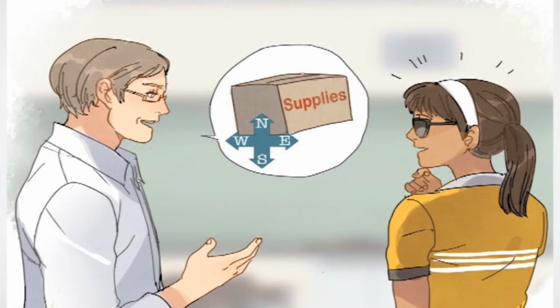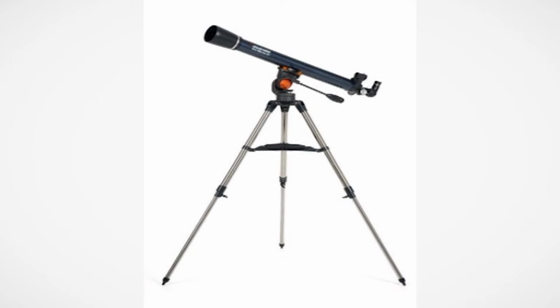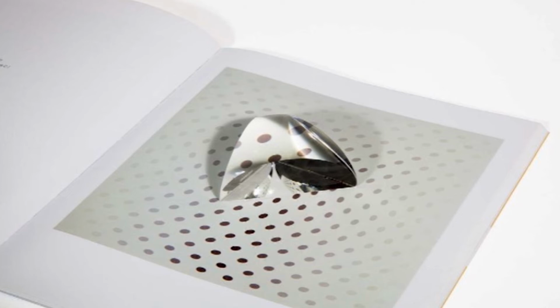These devices are used by blind and visually impaired persons who have severe low vision conditions. Optical devices such as the magnifying glass involve the use of lenses to improve vision. Categories of low vision devices. The two most common low vision devices are magnifiers for seeing objects close at hand, known as near viewing, and telescopes for seeing objects far away, known as distance viewing. Optical devices or aids use lenses or prisms to magnify, reduce, or otherwise change the shape or location of an image on the eye's retina.